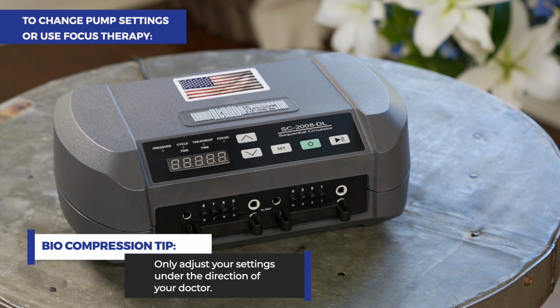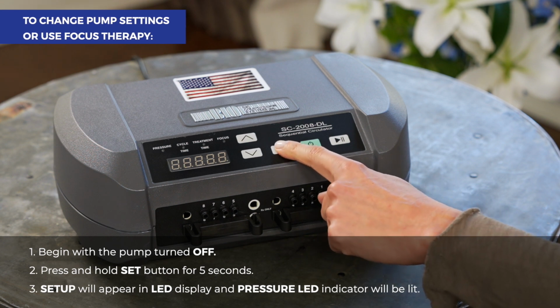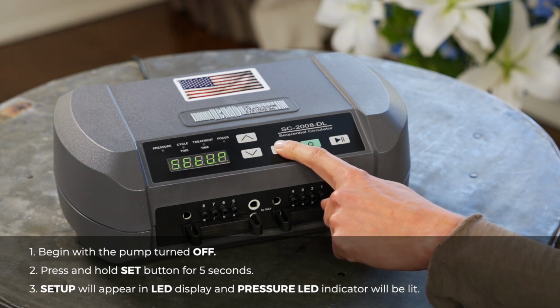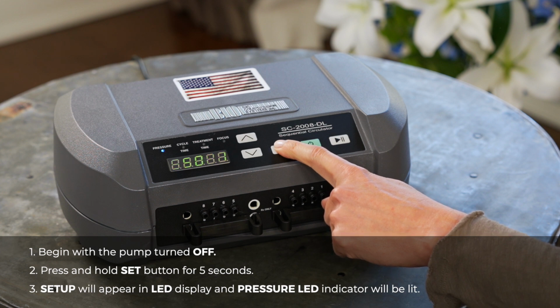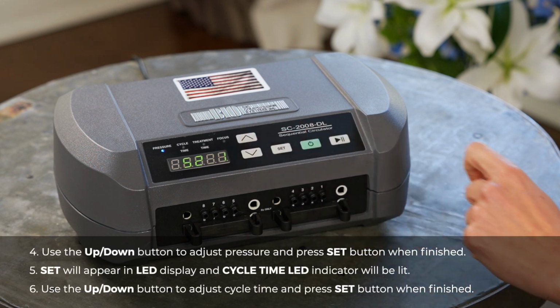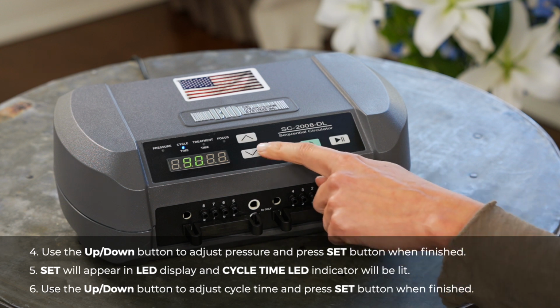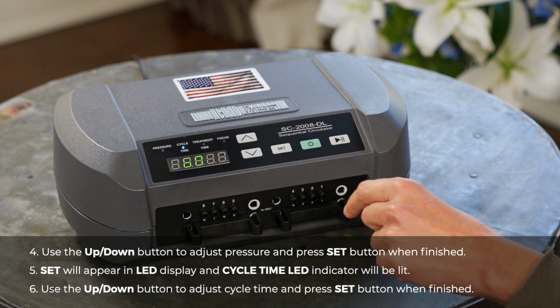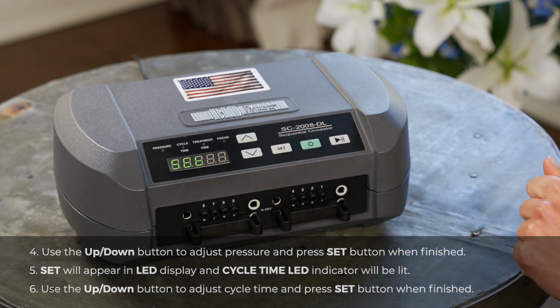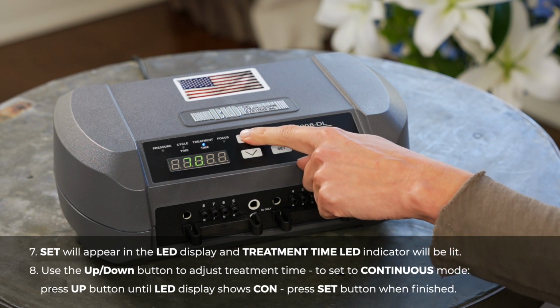To change pump settings or use focus therapy, begin with the pump turned off. Press and hold Set button for 5 seconds. Setup will appear in LED display and pressure LED indicator will be lit. Use the up-down button to adjust pressure and press Set button when finished. Set will appear in LED display and cycle time LED indicator will be lit. Use the up-down button to adjust cycle time and press Set button when finished. Set will appear in the LED display and treatment time LED indicator will be lit. Use the up-down button to adjust treatment time.